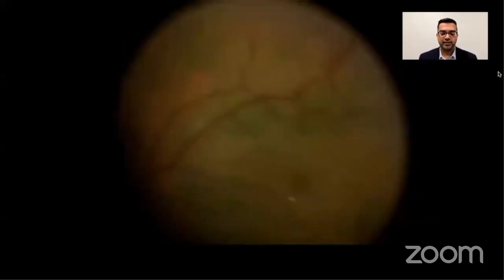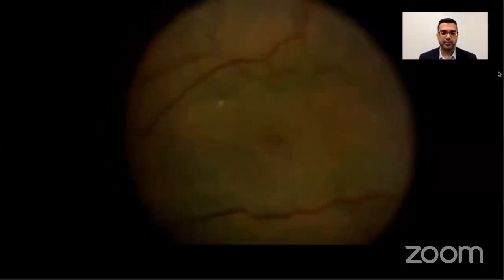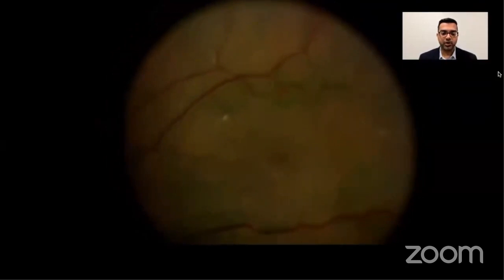Here is a video of a standard epiretinal membrane surgery at our institution. A vitrectomy is completed, followed by instillation of dilute indocyanine green, or ICG. ICG is quickly irrigated out, and you can see very nicely some negative stain from the epiretinal membrane, but also some nice green stain from the internal limiting membrane.